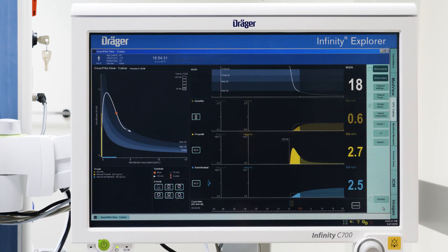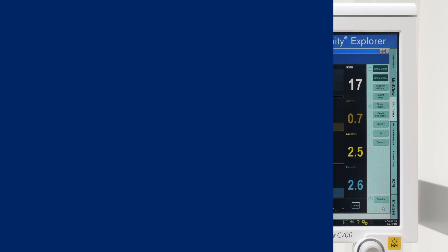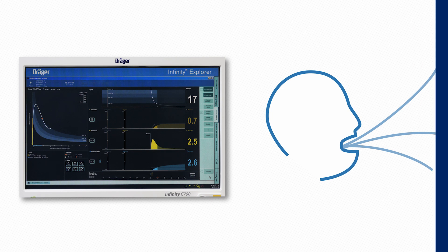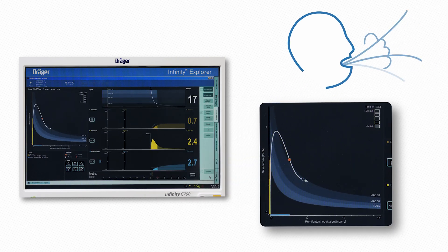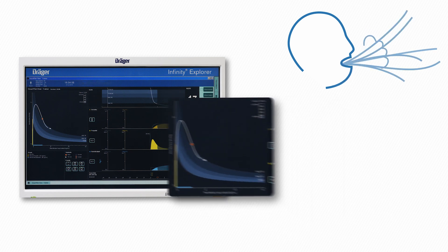Based on pharmacokinetic and pharmacodynamic patient models, the Drager Smart Pilot View software calculates and visualises the combined effects of analgesics and hypnotics, both for the current and the predicted course of anesthesia. Therefore, it can enhance early spontaneous breathing and successful recovery by providing visual information to support precise titration of anesthesia.